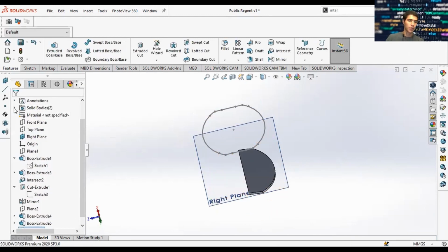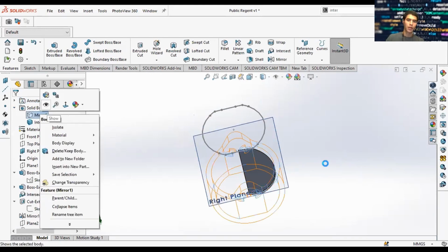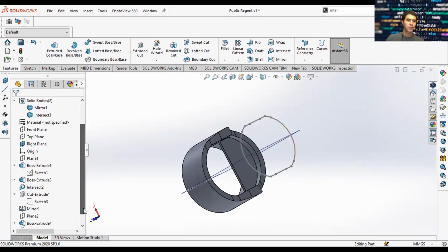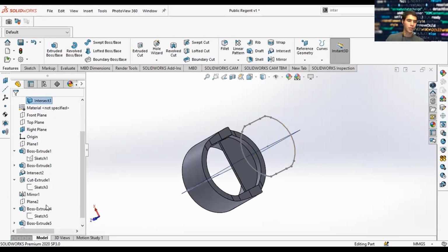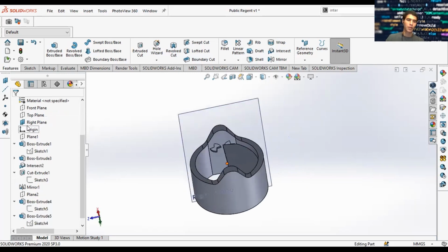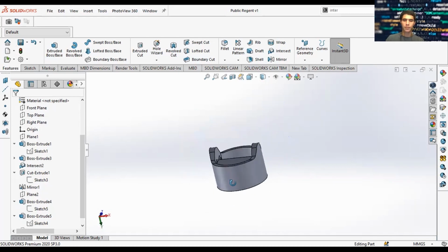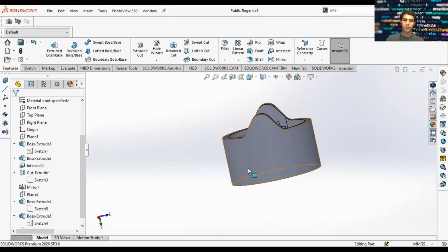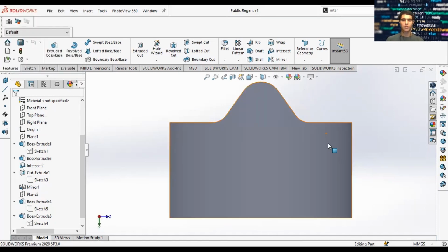And then we have 2 solid bodies. Bring back our other one, and look at our leaflet design. It's right there. So where's our sketch? There's our sketch. Let's hide it. Let's hide the right plane. And do a quick save. So now we have our leaflet design. Let's go ahead and finish this mechanical valve up.